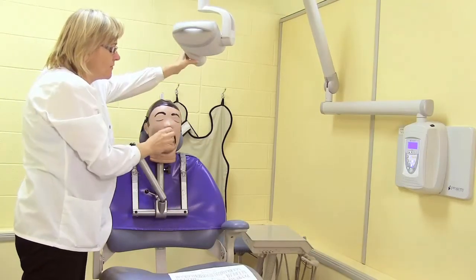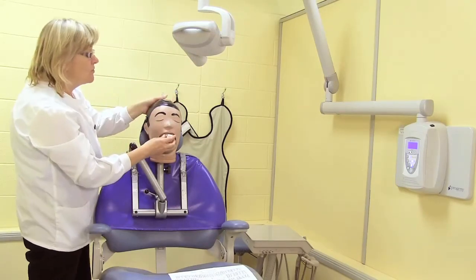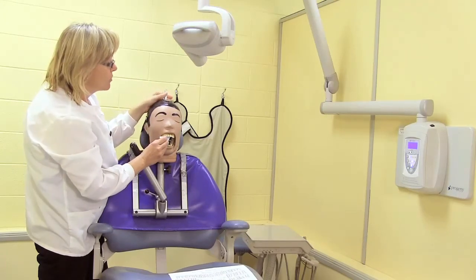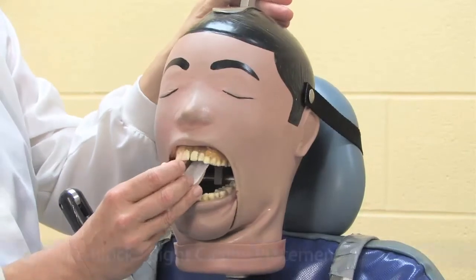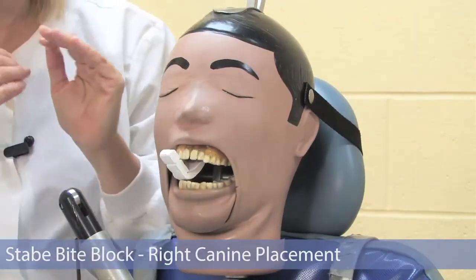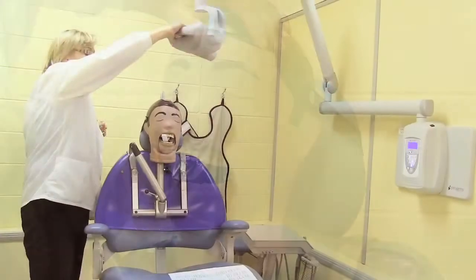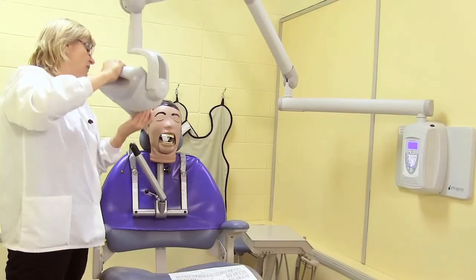Now, I'm going to continue to use the stabe bite block, and I will do the canine exposure. I'll do a quick review of the anterior exposures with the snap array as well. So I look for my canine. My key here is to center the canine in the middle of the film. The film may angulate slightly. It is a size 2 film. Again, my main goal is to make sure the film is straight, flat, not bent or curved.